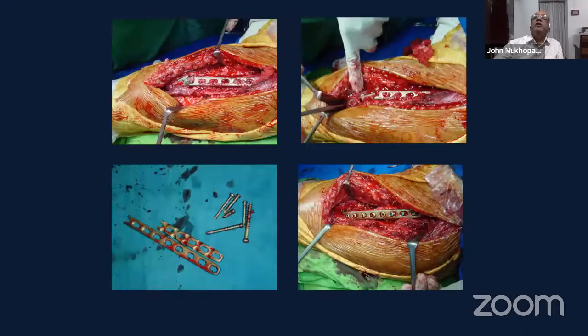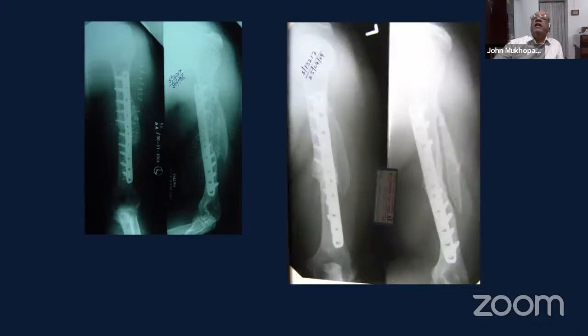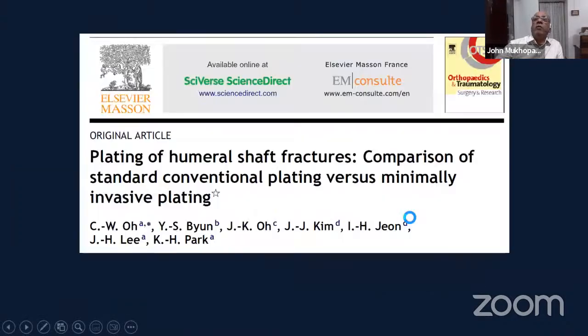And we had to do a revision fixation, a plating with bone grafting. You can see there's adequate bone graft there. We used a long plate with multiple screws to get a kind of absolute stability. And this then went on to heal satisfactorily. Although this fragment is separate, the main fragments have gone on to heal well.